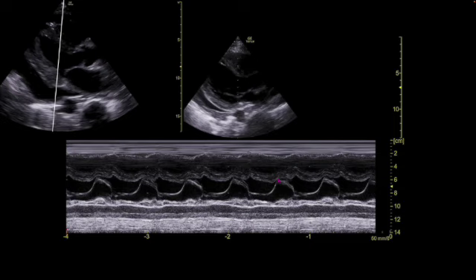We want to know if during diastole, which is when this mitral valve is open, hitting the septum, what is the right ventricular free wall doing? Where's my right ventricular free wall? My right ventricular free wall is here, right? Here's my probe. Here's my subcutaneous area. My right ventricle is closest to my chest wall, closest to my probe. Here's my RV free wall. It's about 2 to 3 centimeters. Here we go. This is my right ventricular free wall.